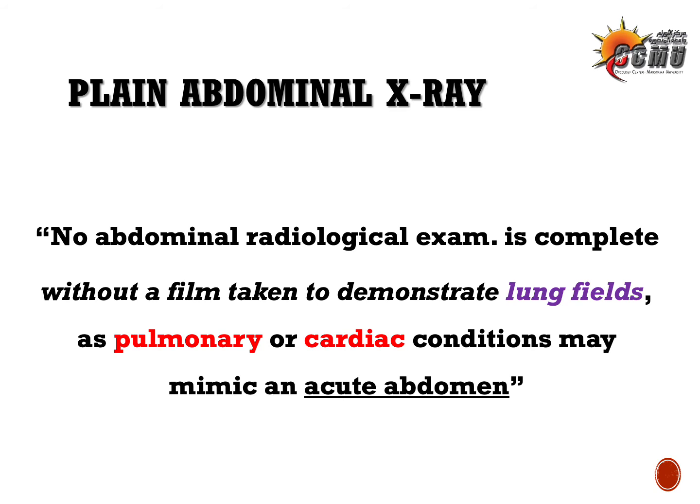It means that when you're doing an abdominal X-ray film, you should take cuts in the upper and lower chest, as much as possible, to delineate any pulmonary or cardiac problems, because these problems may cause acute abdomen and may enter in the differential diagnosis, so that you think your patient has acute abdomen due to an abdominal cause, but actually he has a chest problem, and you've missed that because you haven't had the lung fields examined during the abdominal film.